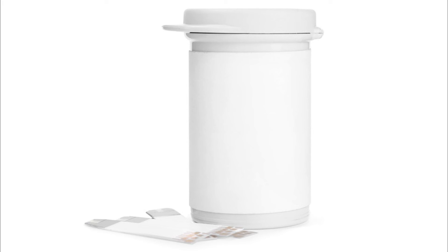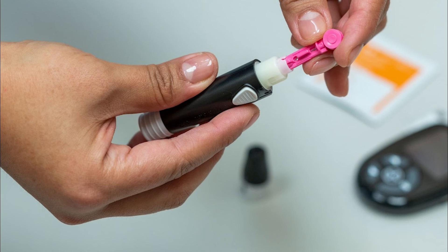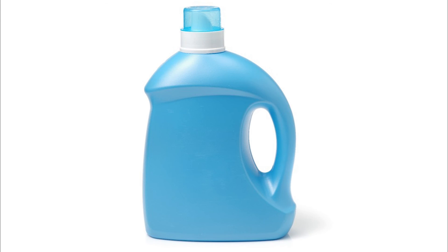Be sure to store your testing supplies in a cool dry place and keep the test strip container cap on tightly. Check the expiration date on your test strips and throw away any outdated ones. Lancets can only be used one time — make sure to throw away used lancets in a safety container. A thick plastic container with a screw top works well, such as a used laundry detergent bottle. When the container is nearly full, seal it with tape and properly dispose of it.